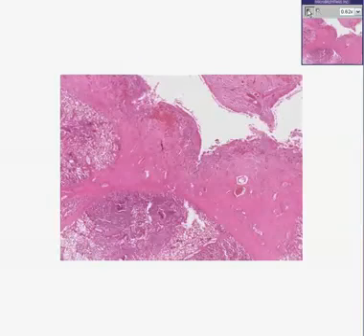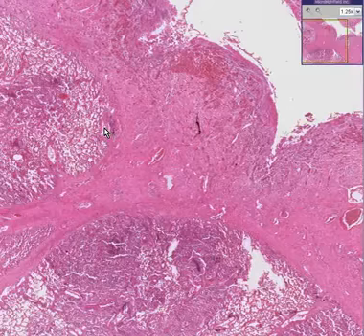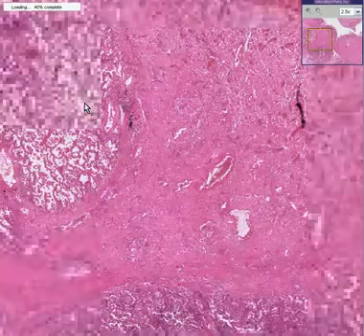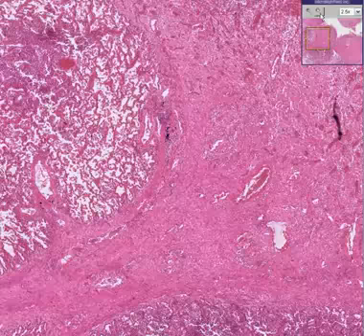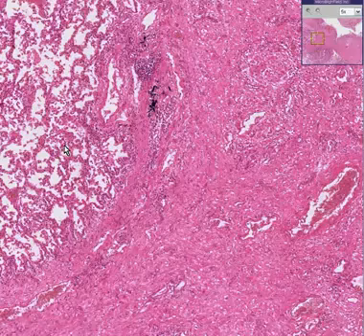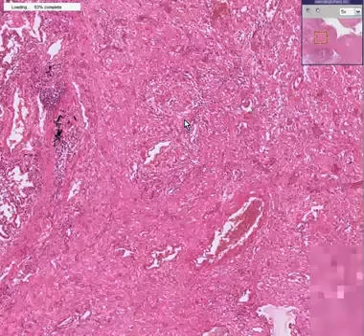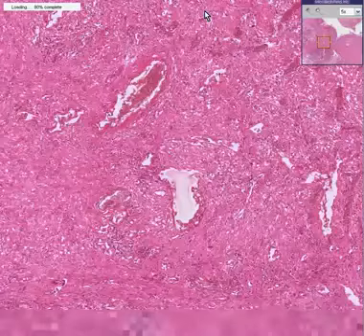Let's look at it microscopically. And we could see, maybe, that here's some area of lung out here, but the lung does not look terribly normal. It looks like there's a lot of cells and fluid edema, maybe blood filling up these alveoli, but at least we could recognize them as being alveoli. What we can recognize as this big, thick, fibrous area is the wall of the cyst, or that big thing that we saw in the gross picture.